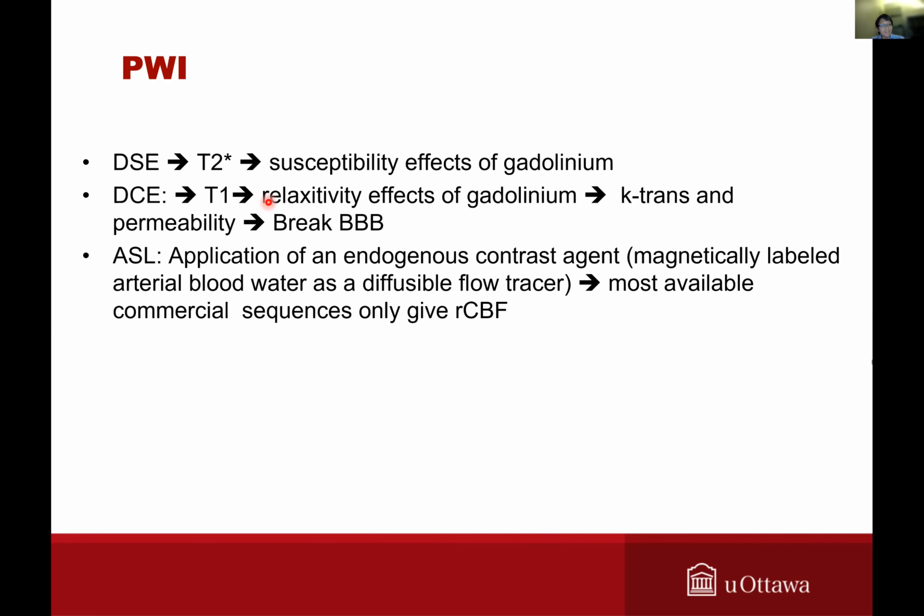So both of these perfusion sequences show different information. One of them is giving you information related to the degree of enhancement of the tissue, how much enhancement the tissue gets due to normal blood, while the second one is telling you how much of the blood-brain barrier is damaged. And when you are assessing the dynamic susceptibility enhancement method, you have to correct for this blood-brain barrier. Otherwise, you're going to have serious problems when you're analyzing your data.